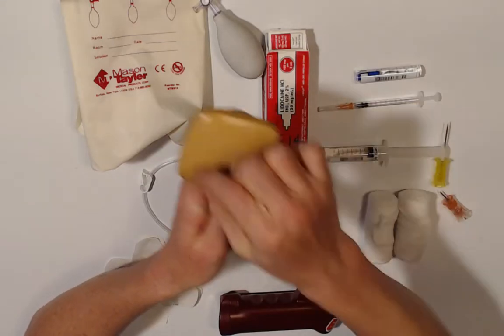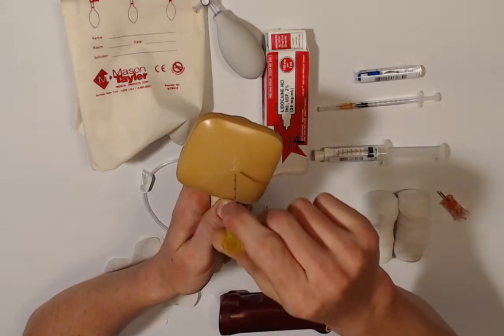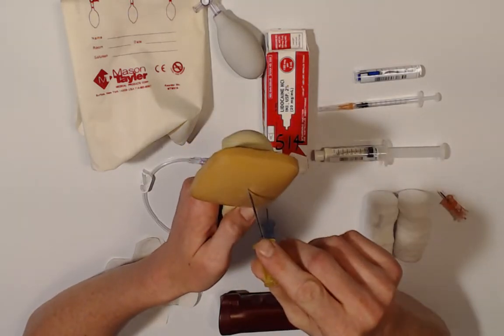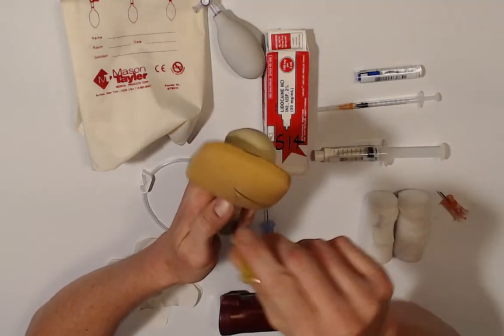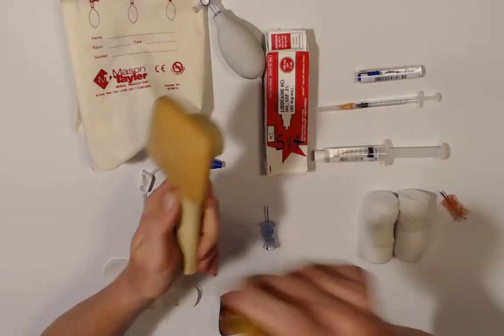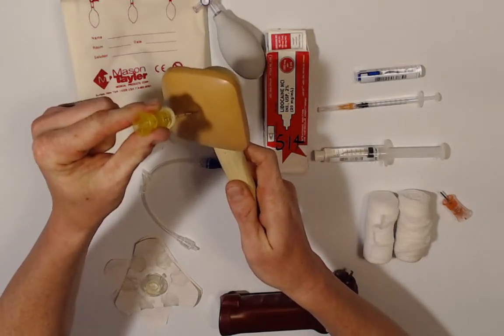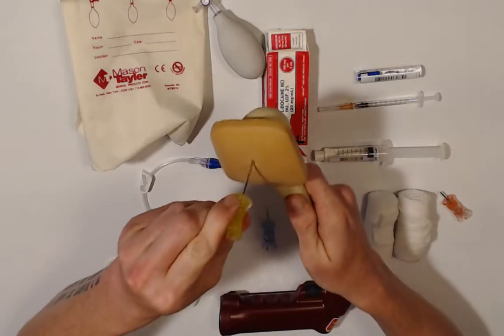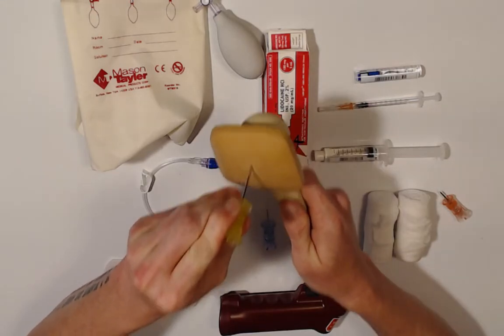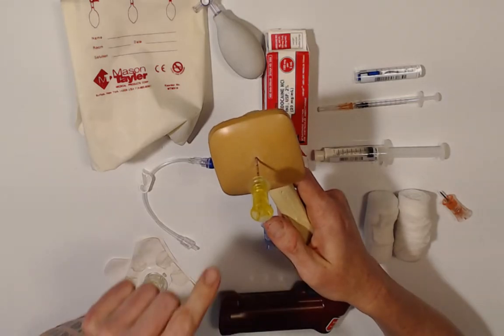Of course, we would disinfect our site, and then we would want to take our needle and go right in. Now for the shoulder, we're going to a 45-degree angle, kind of like downwards towards our patient. So this would be coming at a 45-degree angle. Of course, we go through until we feel it hit the bone. Okay. At that point, I would go ahead and drill.